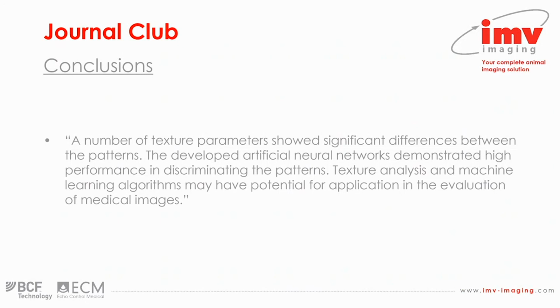So all in all, this seems like a reasonable study, effectively in the context of a pilot study, as a proof of concept that the machine learning algorithm is able to differentiate the lung patterns, at least in certain situations and at least in certain conditions, and that conceivably that may then have application in clinical practice, but that a lot more work is needed to validate this particular algorithm in some of the more challenging situations, and in particular on equipment that is not the same as the equipment used in this particular study.